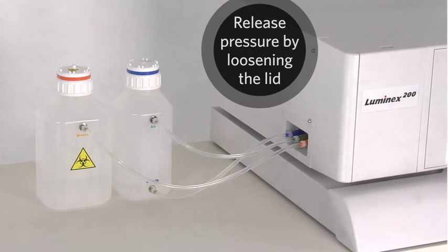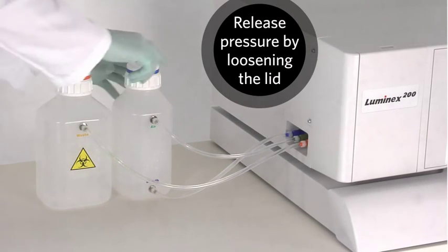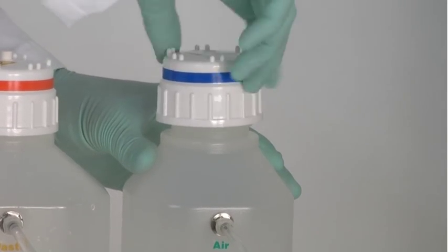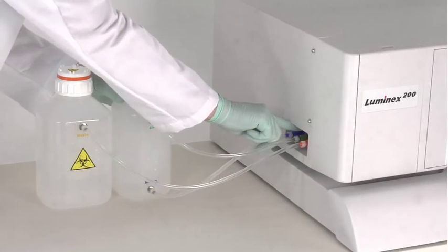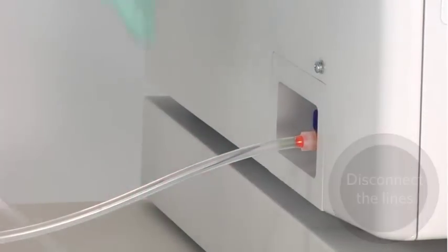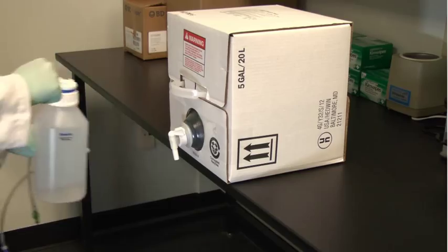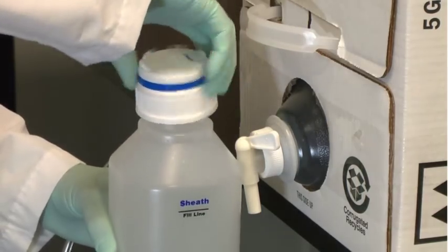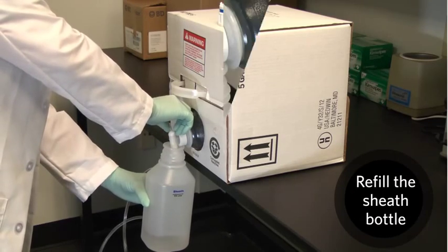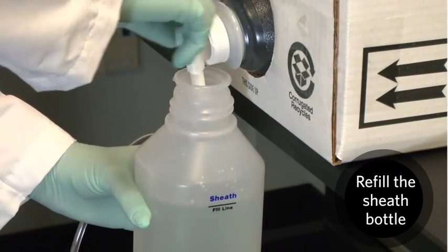If the reusable 1-liter bottle is being used, release pressure by loosening the lid. Disconnect the sheath and air lines from the Luminex 200. Remove the lid. Then refill the sheath fluid container with diluted concentrate or fluid from a 20-liter container.